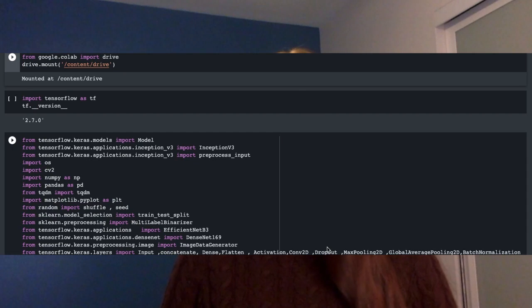The project I chose to start with is the classification of the NIH chest x-rays dataset, containing 5,000 images with 15 different classifications of different cardiac or chest conditions, or of no findings. To make this model, I used Google Colab, which is a free resource on Google Drive for anyone who wants to write code, and I coded my model with Python. I also used TensorFlow as my library.